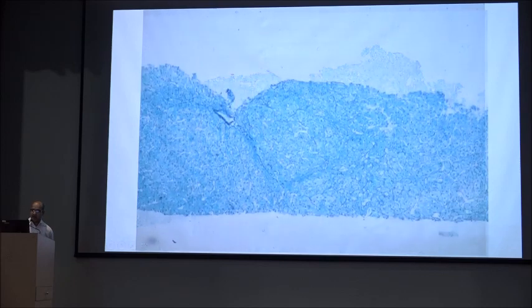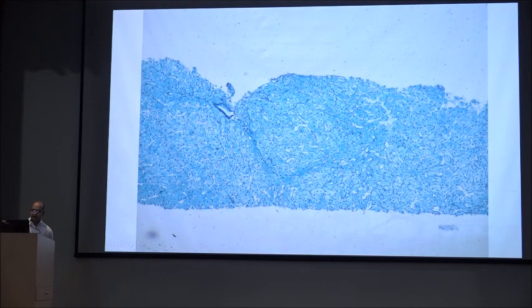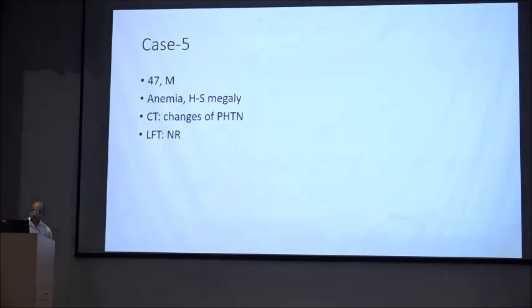And this is another area which is showing the compressed hepatocyte cord with reticulin condensation, and it is circumscribing the normal or regenerating or thickened plate of the hepatocytes. So this is a reticulin stain, and diagnosis in this case is NRH, nodular regenerative hyperplasia.